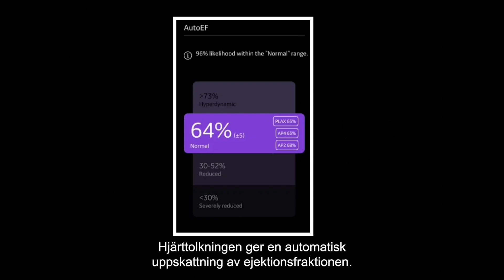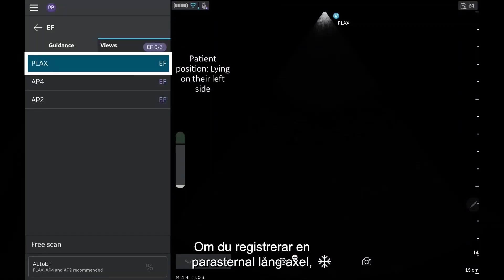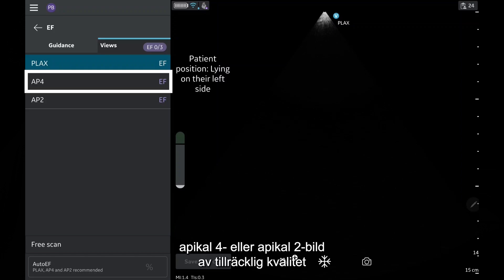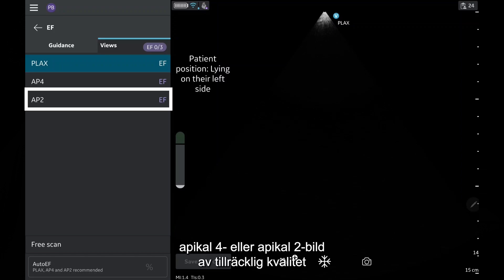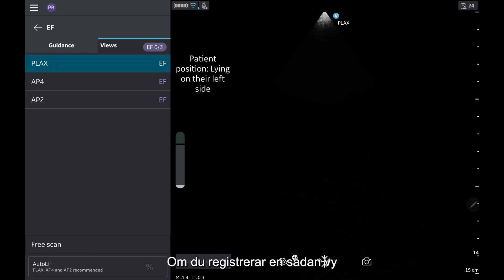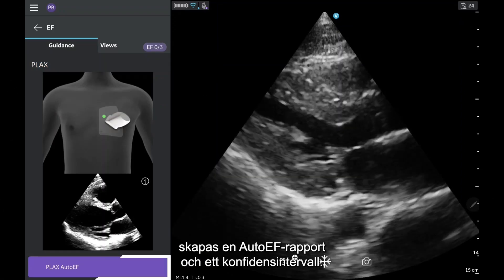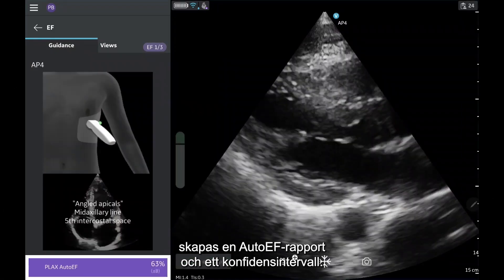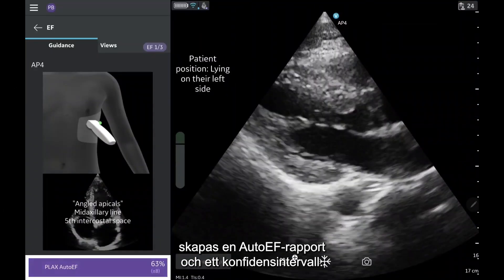Cardiac interpretation provides an automated ejection fraction estimate. If you capture a parasternal long axis, apical 4, or apical 2 image of sufficient quality, the auto-EF algorithm automatically calculates an ejection fraction. If you capture one of those views, you will see an auto-EF report created along with the confidence interval.